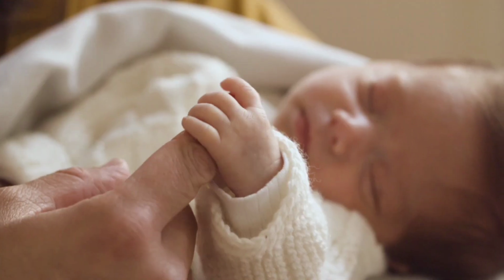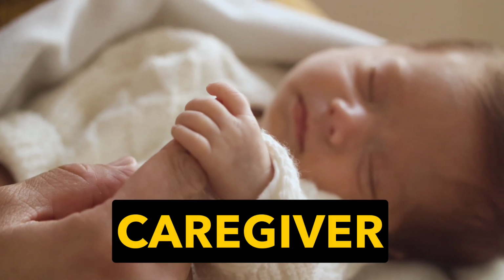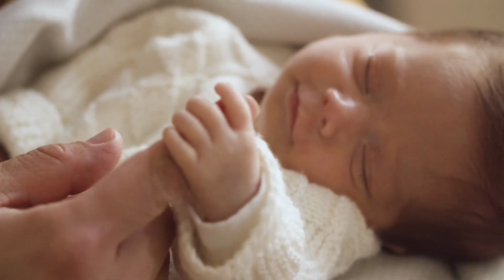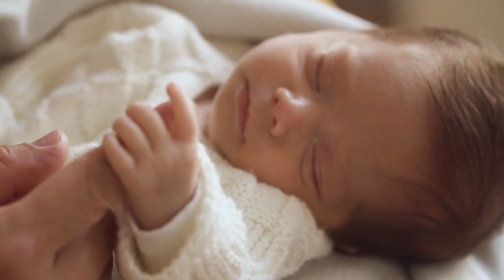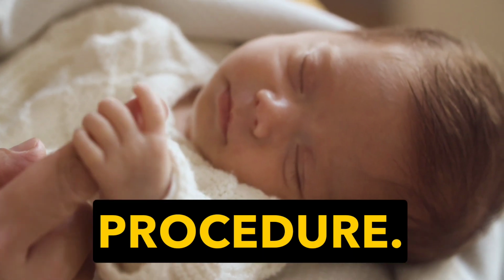Preparation. 1. Psychological preparation. Explain the procedure to the child and caregiver using simple terms. Use distraction techniques, for example, toys, videos, or comfort items. Reassure and comfort the child throughout the procedure.